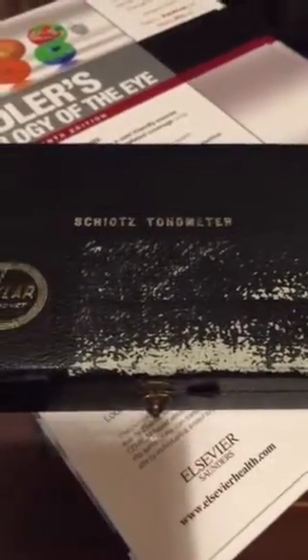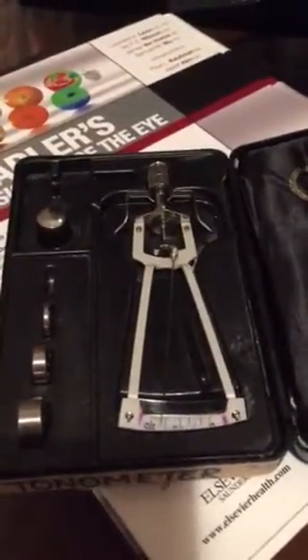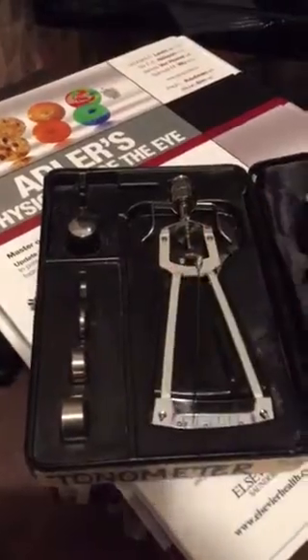Hi guys, we're going to go through the Schiotz tonometer quickly. This is the device here. We've got four different weights: 5.5 grams, 7.5 grams, 10 grams, and 15 grams.